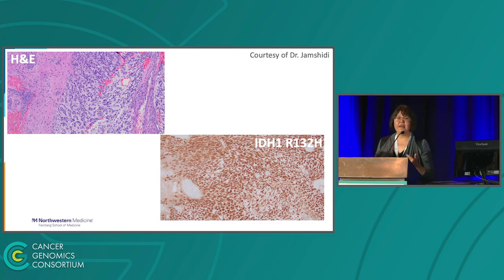So you can see that, not surprisingly, this tumor was IDH mutant. We knew it from IHC, and TERT mutant. So this case was rightfully reclassified as oligodendroglioma, IDH mutant, 1p/19q co-deleted. Microarray also helped to grade it as grade 3 because of homozygous loss of CDKN2A and B.